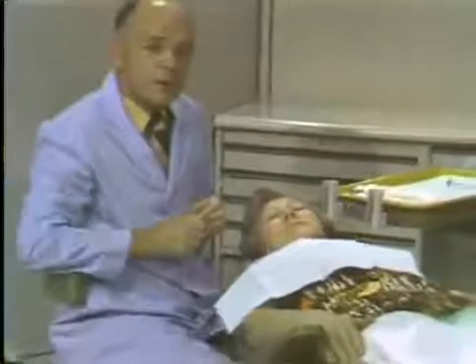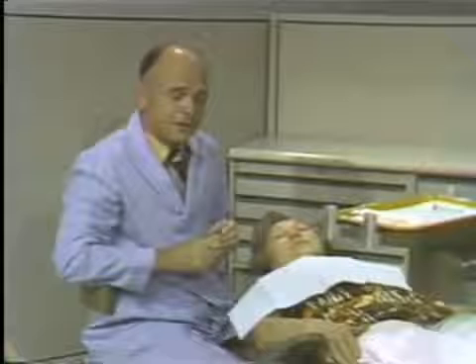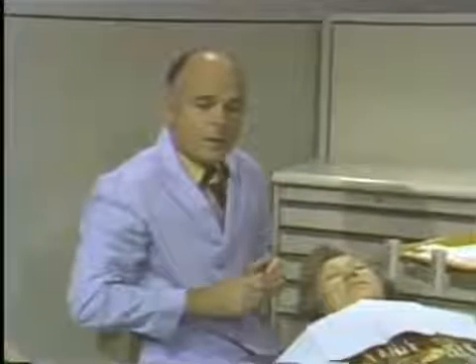In the maxillary arch, in this position, you'll be using the mirror almost constantly. Some direct vision is possible, but for the main, the mirror will be mandatory. Now with an assistant, the use of the mirror is relatively easy because the assistant will be washing and drying the mirror constantly. When you're operating alone, it is more of a problem.